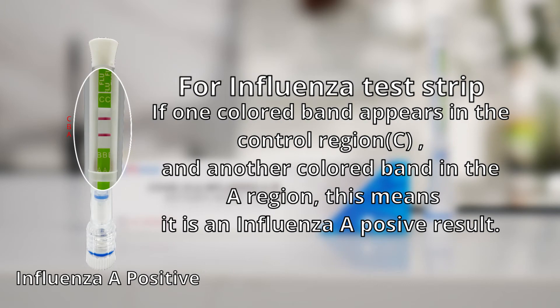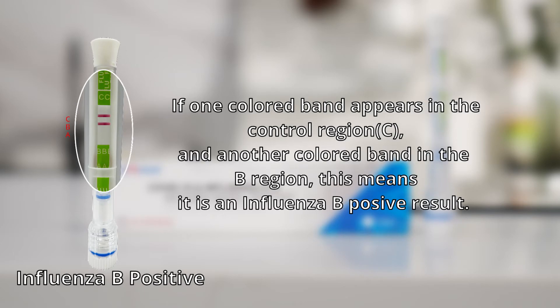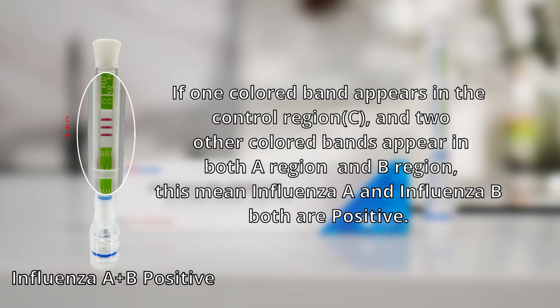For the influenza test strip: if one colored band appears in the control region C and another colored band in the A region, this means influenza A positive. If one colored band appears in the control region C and another in the B region, this means influenza B positive. If one colored band appears in the control region C and two other colored bands appear in both the A region and B region, this means both influenza A and influenza B are positive.